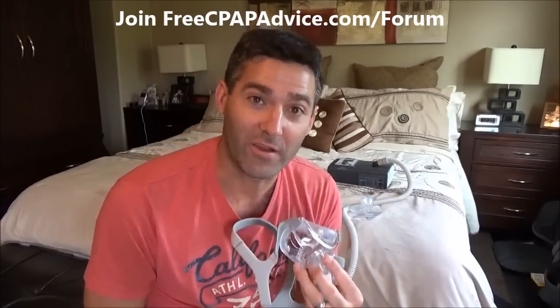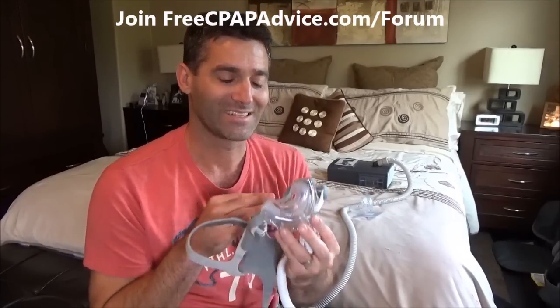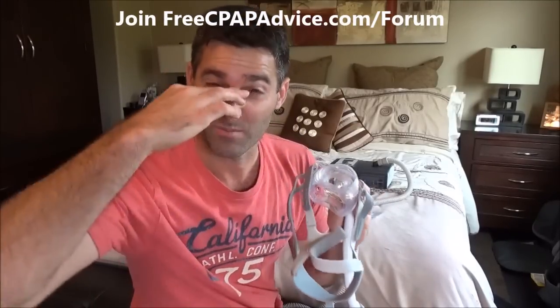Anyway, what we have here is the Amara View. It's by Philips Respironics. It's been out for a while. It is a full face mask, but it's not exactly the traditional full face model that comes up over the bridge of your nose. This actually, you rest it like so. So you have no pressure on the top of your nose. Instead, your nose fits on here. Kind of interesting design. I actually like the design.